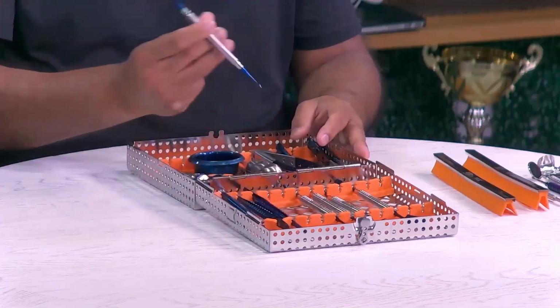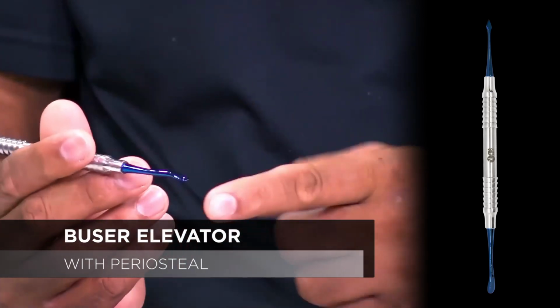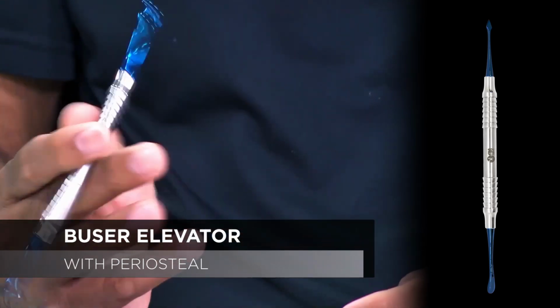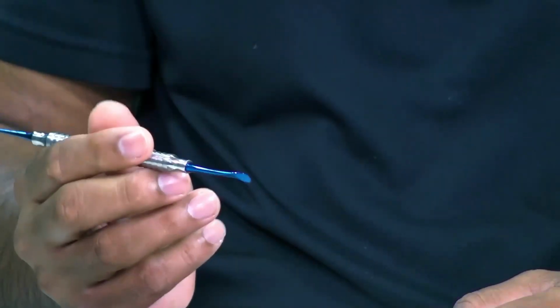So now let's move into the next realm, and that's if we're going to be laying a flap or reflecting flaps. There are two instruments that I want to focus on here. The first instrument, I call this the reflector. It technically has a Buser type instrument on one end and a periosteal on the other end. I find that the Buser instrument is fantastic. It's very sharp, nice and pointed, and does a great job of doing the initial reflection, getting the flap off the bone. And then, of course, we'll use the periosteal end to do our full thickness reflection all the way down. So this instrument was specifically designed and built to get the initial part of the flap out and then do the full reflection as well.